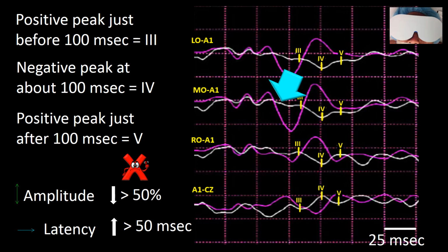The white wave in this frame being pointed by the aqua arrow is the real time, and as in the prior frame, although the arrow is pointing to one derivation, the same can be said about all 4 derivations.